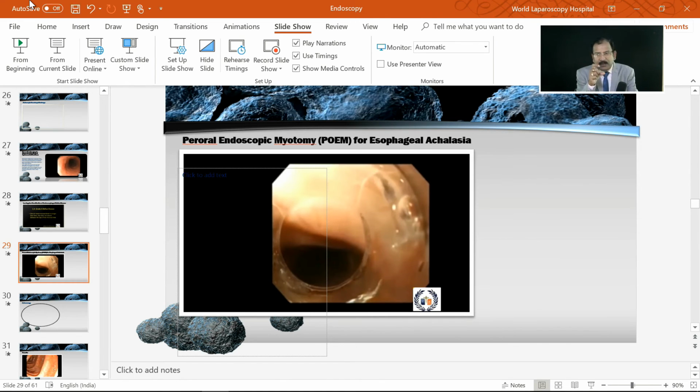Once you put the finger on the front button, and if bubbles are not coming, that means air is leaking somewhere. And then you will struggle during the procedure because you want to distend and it won't distend the lumen. So these technical things should be checked before. And exactly the same way you press it and you will see fluid is irrigating or not. If fluid is not irrigating, that means connection of the bottle is loose and it is leaking from there only. All the fluid is coming on the floor. So leak means this.